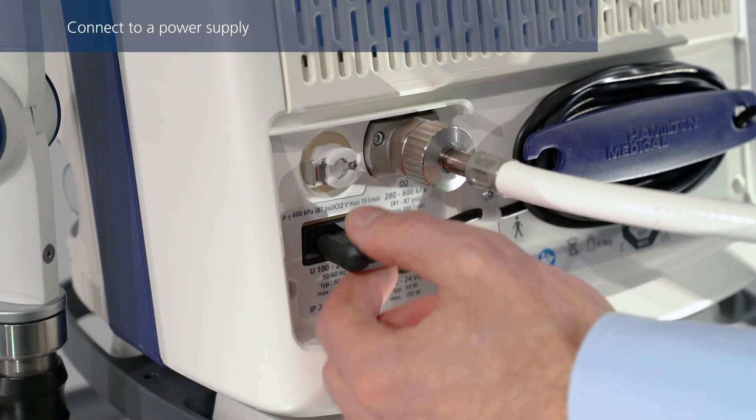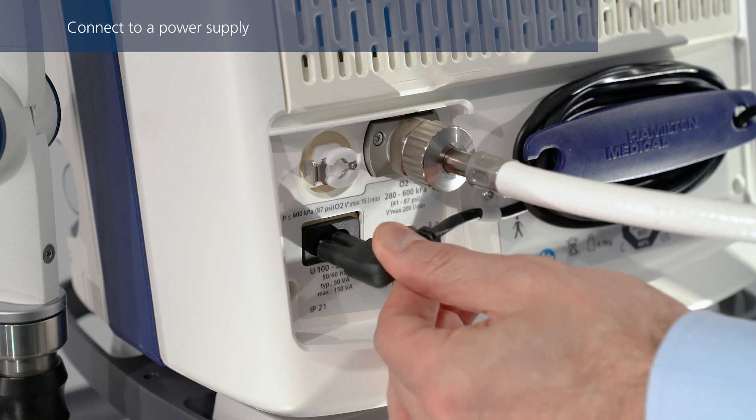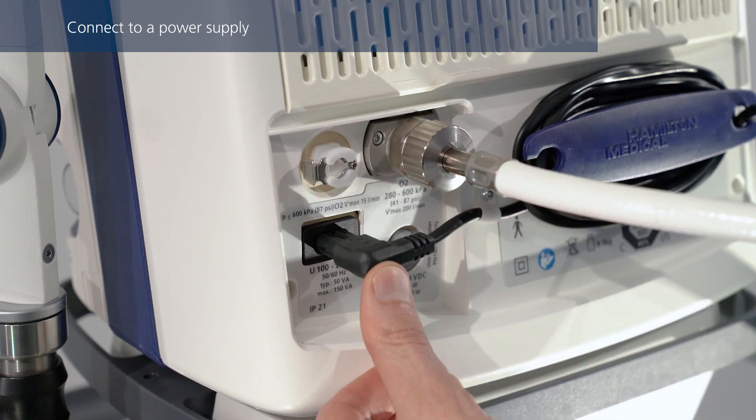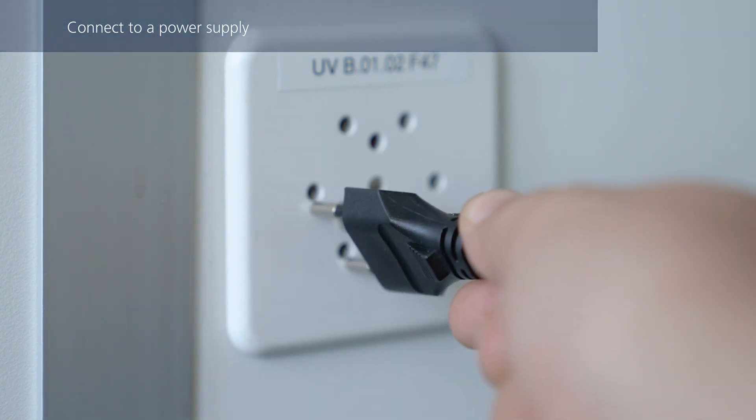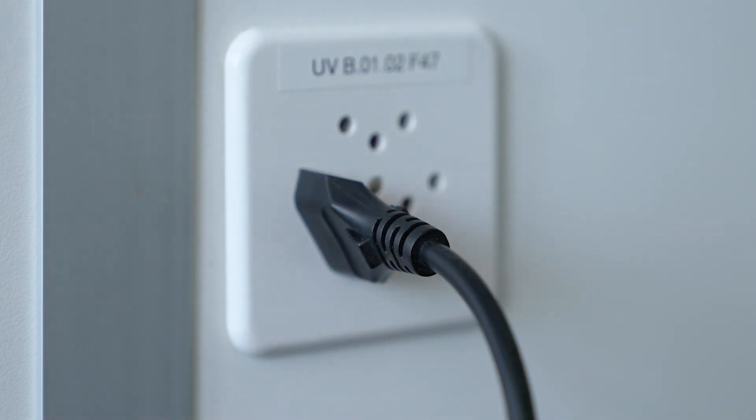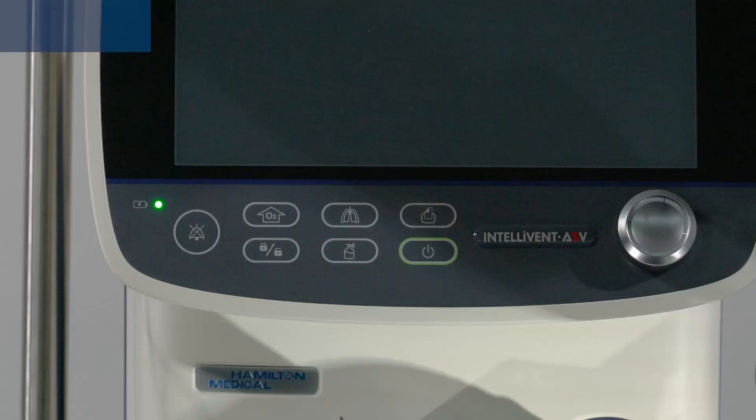Make sure the power cable is firmly connected in the socket to prevent accidental disconnection, and then connect it to the primary power outlet. The battery charge indicator shows the charge status of the battery, even when the ventilator is turned off.